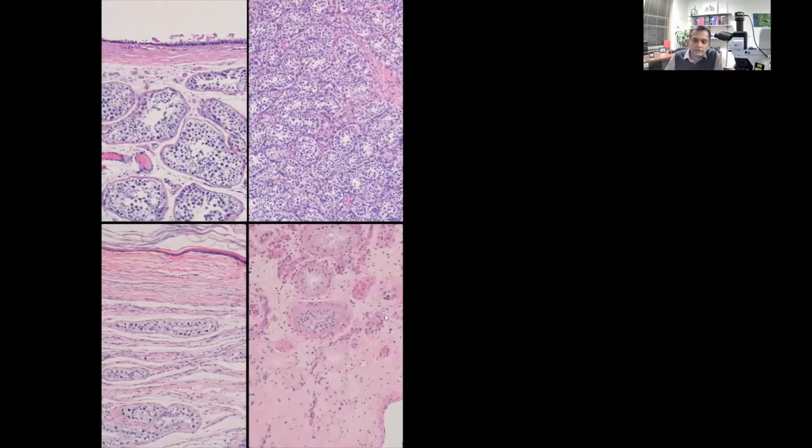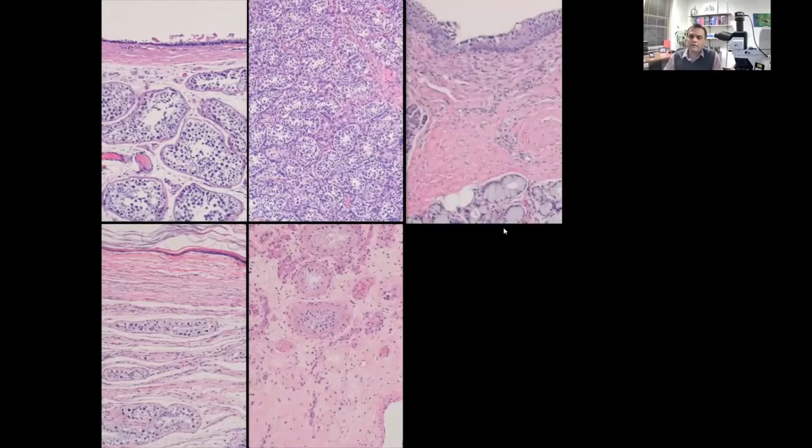So you get this microlithiasis, you get areas of scarring, you get atrophy, complete atrophy of the seminiferous tubules, or sometimes you get partial atrophy with Sertoli-only cells. So you find areas of dysgenesis. And then if you look at the teratomatous elements, we'll see that they have this organoid pattern. So this could be just a section from either the bronchus or trachea, where you find the squamatized respiratory epithelium and the underlying smooth muscle layer and these well-formed mucus glands with very bland cytology.